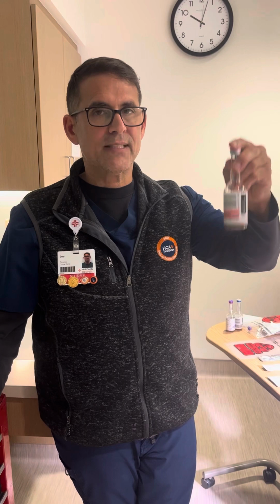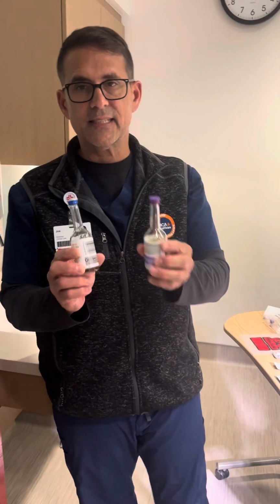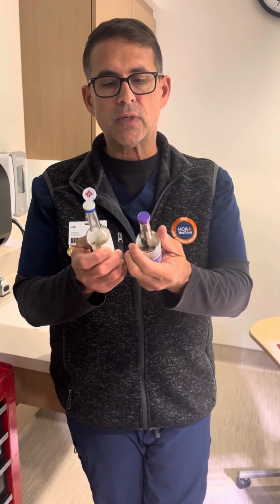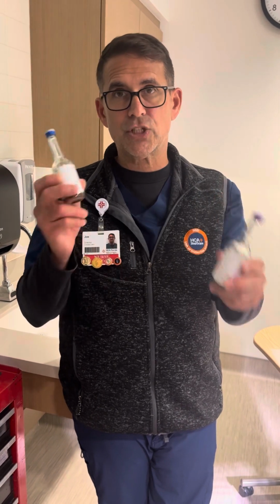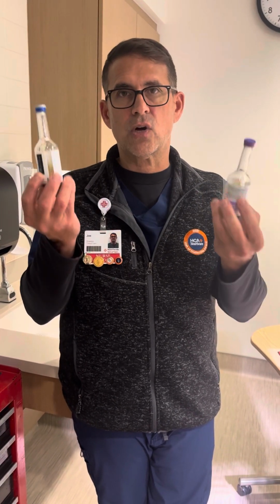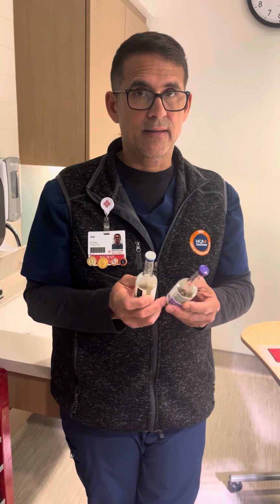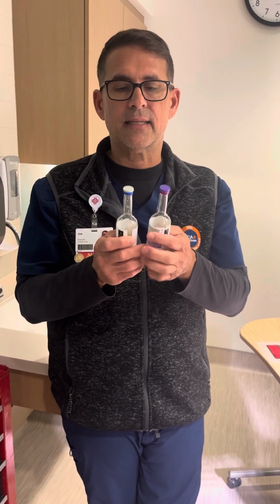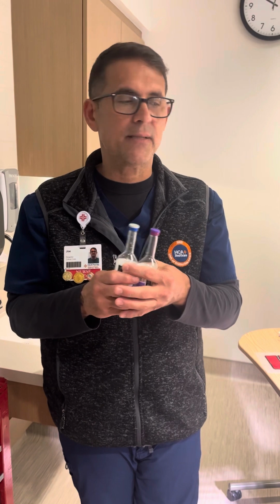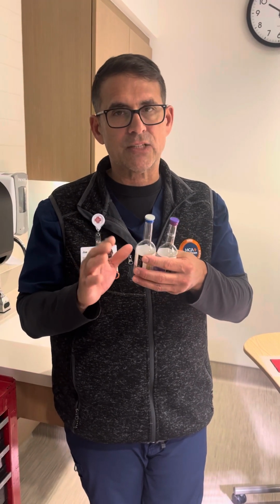of blood culture. When I say a set, this is 1 set, okay? And on the bigger kids, this is one set. These tubes need a minimum of 5 mLs, 7 to 8 mLs is better each. So you're looking at a 10 ml draw minimum for these. This is a more accurate blood culture than the pink one. And it gives you aerobic and anaerobic, and it's just easier to identify the organism, but it needs more blood. So this is why we don't use it in pediatrics as much.